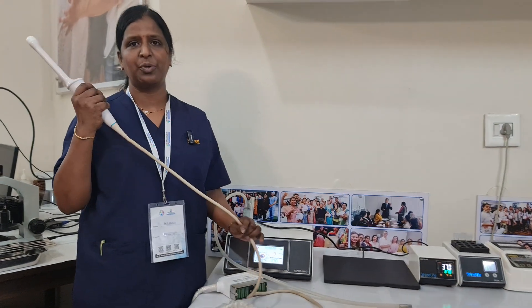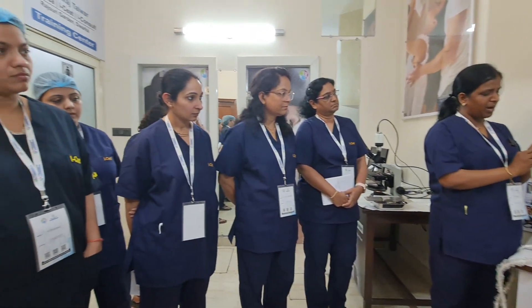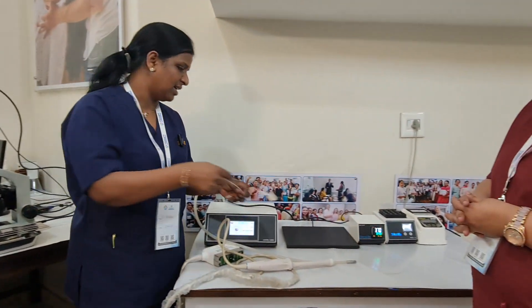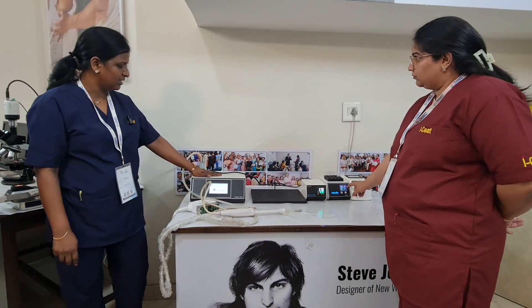The first and foremost thing every gynecologist will have is the transvaginal probe and the needle guide. The needle guide will fix here and we'll have one mark here. As my colleague already explained, this is the OPU needle, 17 gauge.